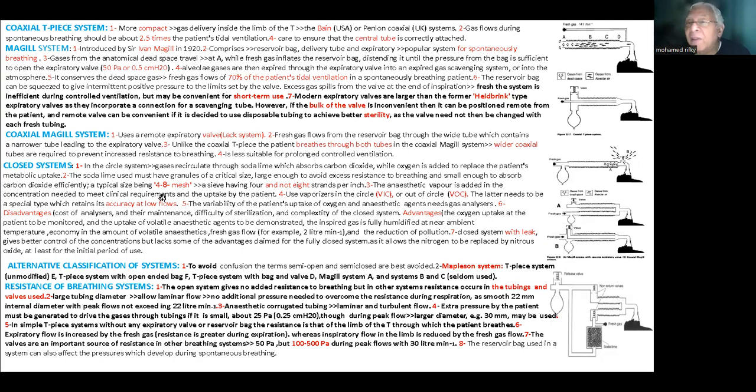So whenever I say what's the meaning of 4 to 8 mesh, that means that we have a mesh where 1 inch, if we divide it into 4 or 8 by 4 or 8 strands, will permit the size of this particle. So it will have less resistance and more efficiency in absorption. This is why we call it 4 to 8 mesh.